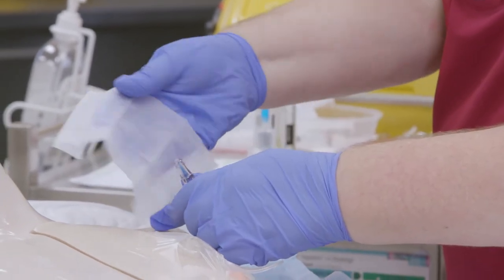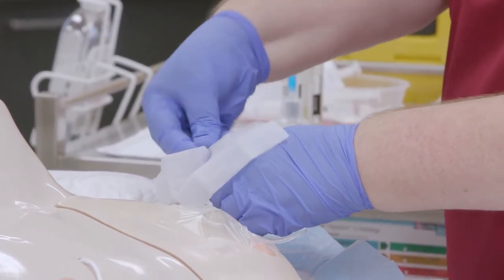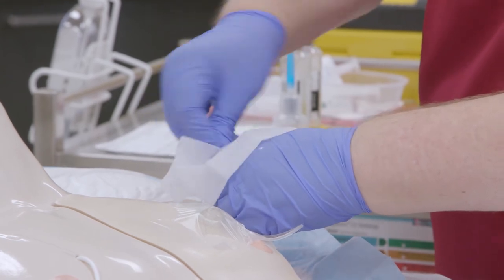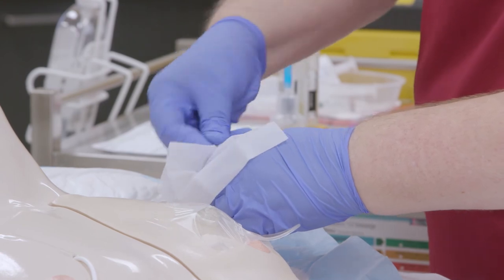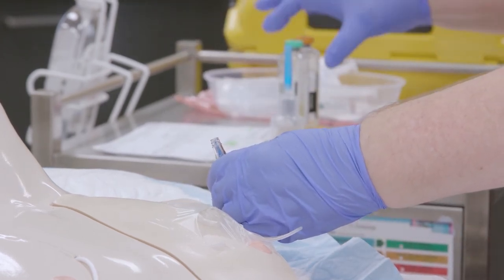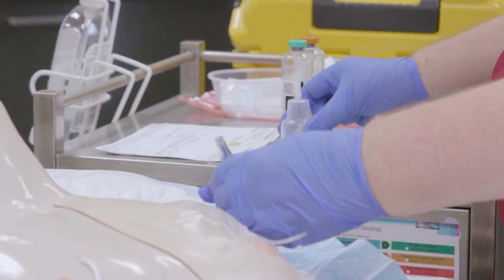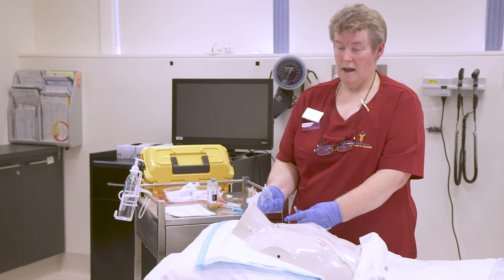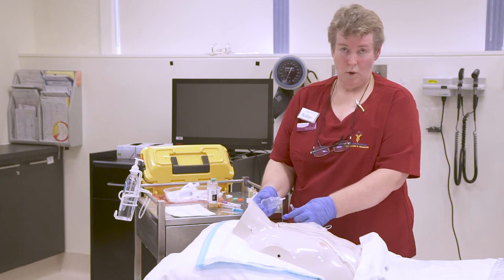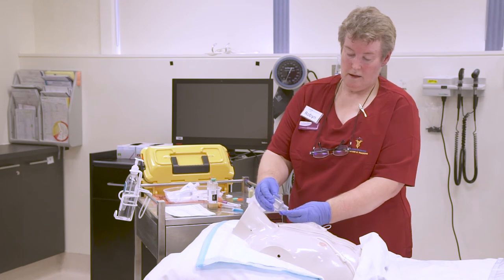Really important to make sure you open up your Clinell swab and scrub the top of the neutron connector as well as around the sides, again for 15 seconds, and we must let it dry for 15 at least. Now, protecting your key parts using your non-touch technique, we are going to connect our Vacutainer to the connector. At Ballarat Health Services, our connector isn't Luer lock, so we do need to support it with our hand. Like so.